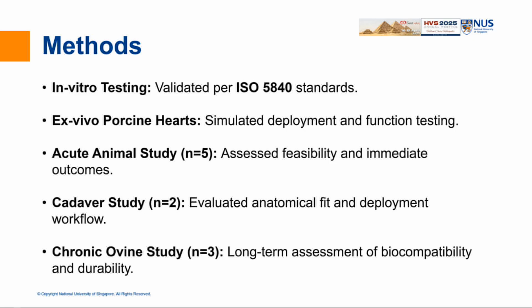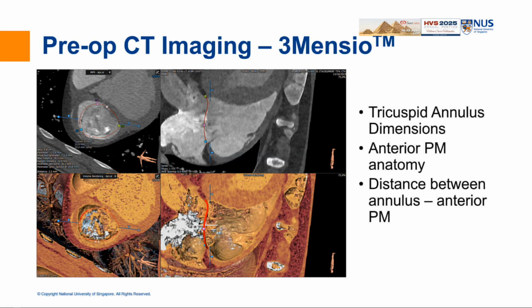and have done ex vivo porcine heart experiments, as well as acute animal studies, 4 porcine and 1 ovine study. We implanted it in 2 cadavers, followed by a chronic ovine study just completed very recently. Given the time limit, I'm not going to describe all of these. Let me touch on the most important key points: how we implanted this device into the recipients.